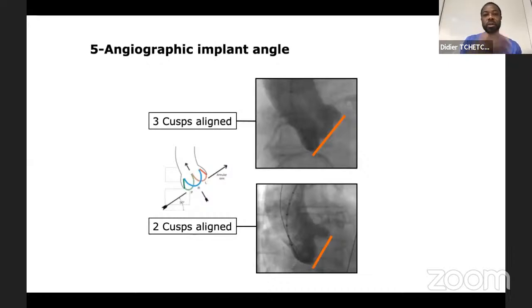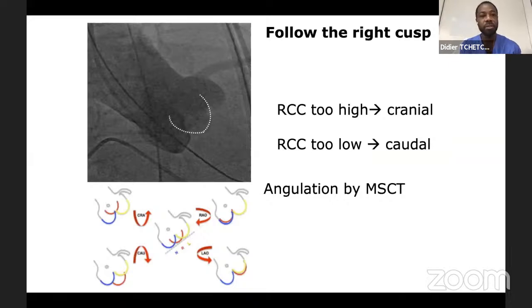Depending on the device, you may use the free cusp view or the cusp overlap view for fluoroscopic angle projection. If working with the free cusp view, we recommend the 'follow the right cusp' rule. In LAO, pull apart the left coronary cusp and non-coronary cusp, put the right coronary cusp in the middle, and just follow it. If it appears higher on screen, move the C-arm cranially to bring it lower. If it appears lower, bring the C-arm caudal to lift the right coronary cusp. It's very easy — just follow the right cusp.